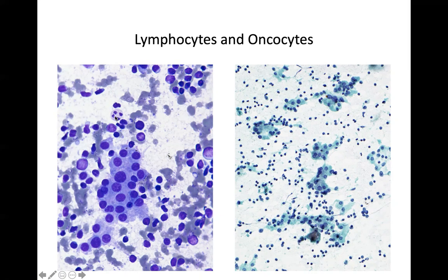So some of you who've done cytology before maybe know that this could be, and I'm really lagging here on my computer. I'm really sorry. So some of you said benign, some of you said atypia of undetermined significance, some of you said FLUS. So depending on where your threshold is, all are certainly possible.